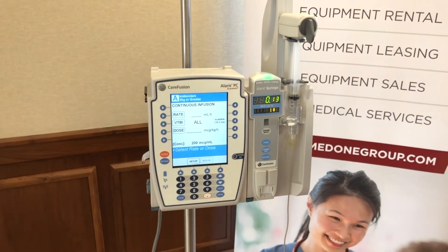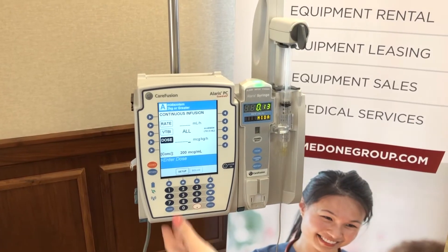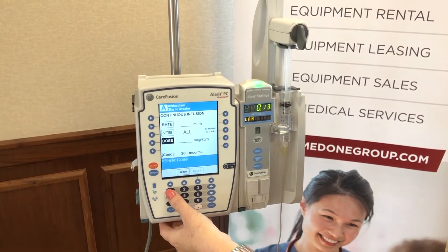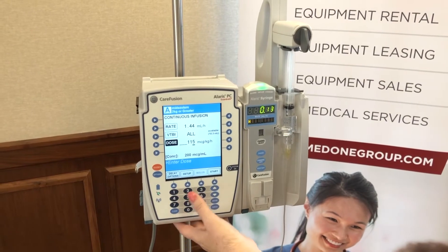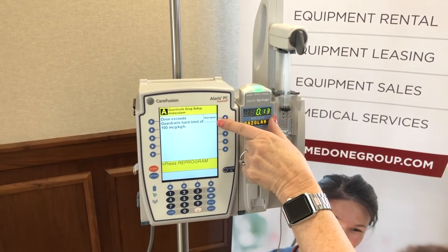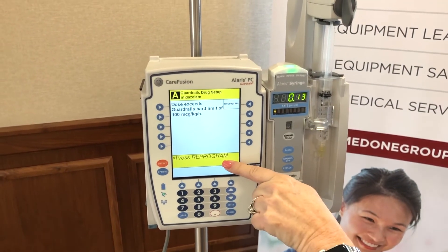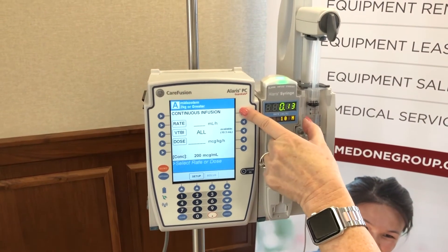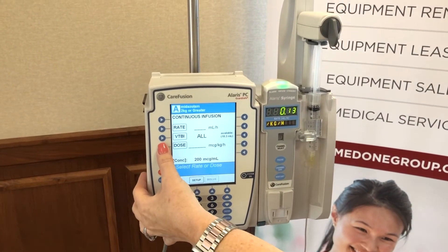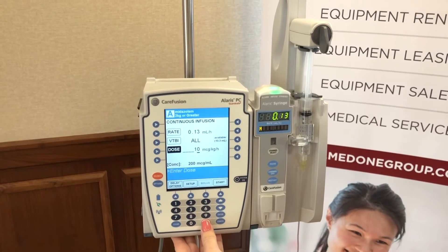Now I want to show you a hard limit. She thought she put in 11.5 but entered 115 — missing that decimal. She presses start. This is an example of a hard stop: you cannot go above that limit. You must press reprogram and go back and enter something less than what pharmacy has set. We go back to our 10 microgram dose and press start.